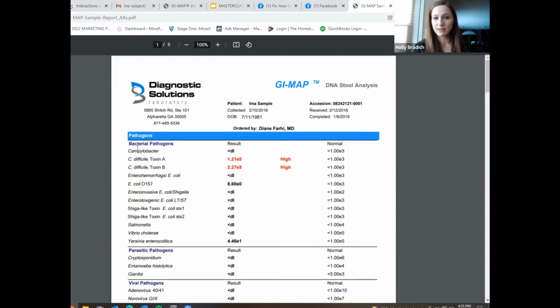Now these are specific types of E. coli that, as far as I know, are quite toxic and harmful. However, E. coli is a normal part of our gut microbiome. And without it, we can't actually make some vitamins. So we need it. But when it gets out of control or there's more harmful strains like the ones listed here, we are going to have a problem, right?